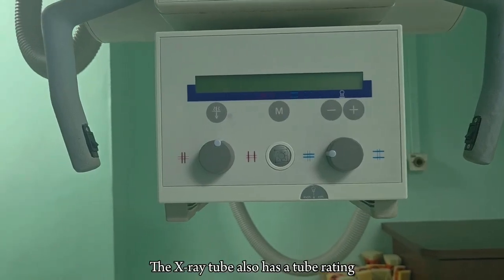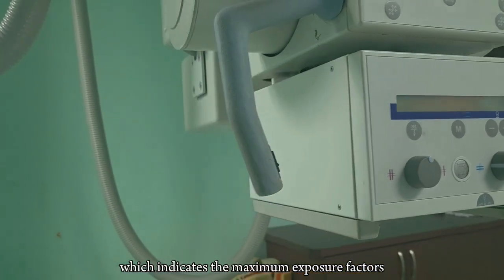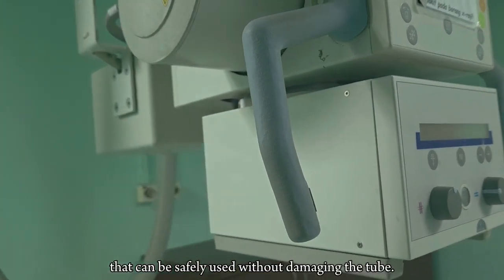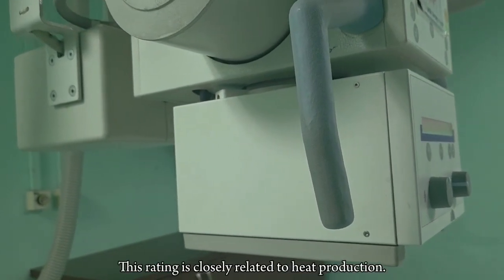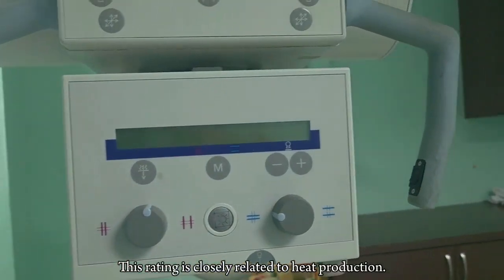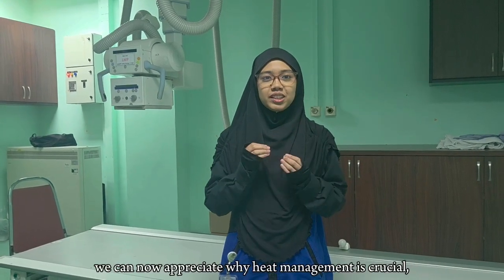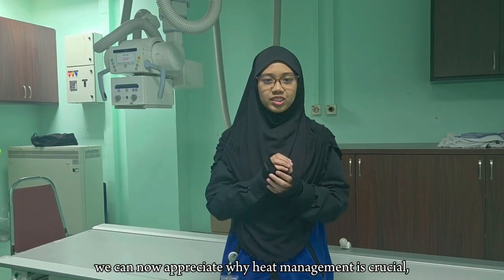The X-ray tube also has a tube rating, which indicates the maximum exposure factors that can be safely used without damaging the tube. This rating is closely related to heat production. Understanding the X-ray tube structure and design, we can now appreciate why heat management is crucial, which will be explained further by Fatihah.